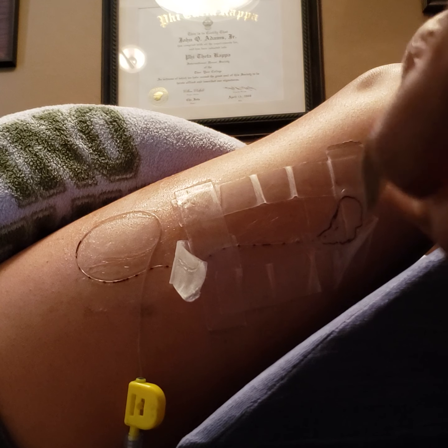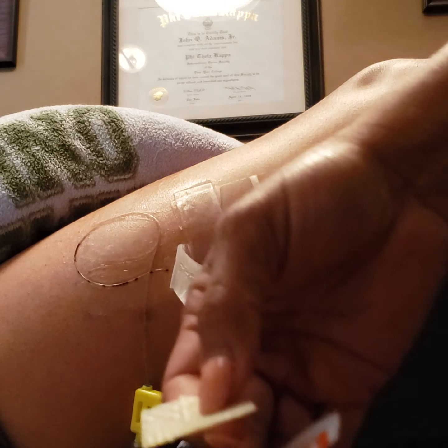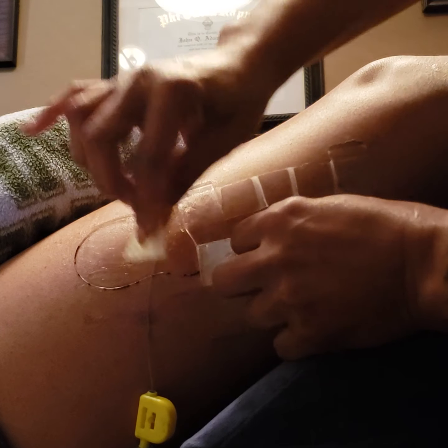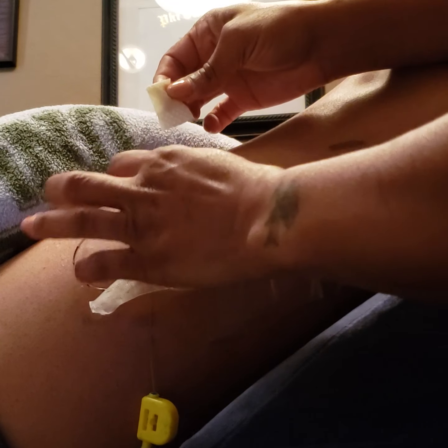The nurse tried to give me about three packs of adhesive wipes, but I asked her to give me as many as she could, because three packs — especially if they have this much tape on it — won't do it.